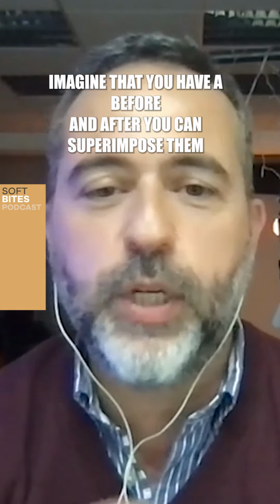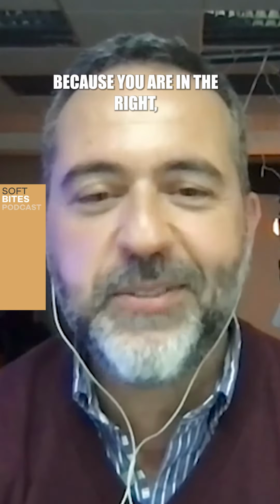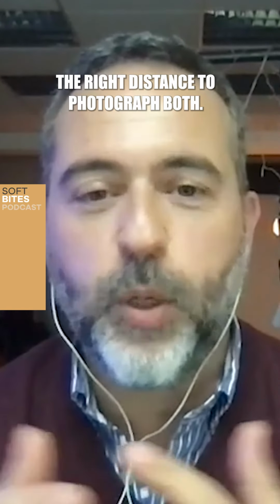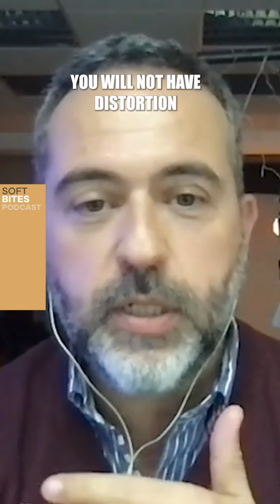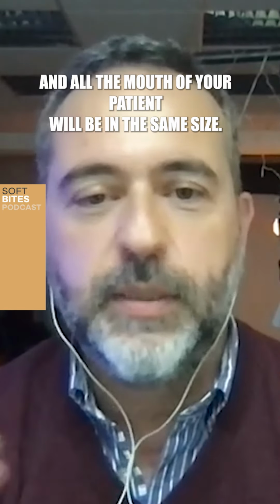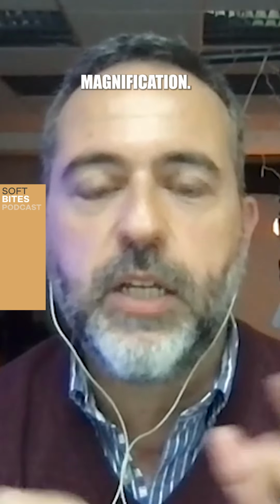Imagine that you have a before and after. You can superimpose them because you are at the right distance to photograph both. You will not have distortion, and all the mouths of your patients will be the same size, okay? So this is the first important thing, magnification.